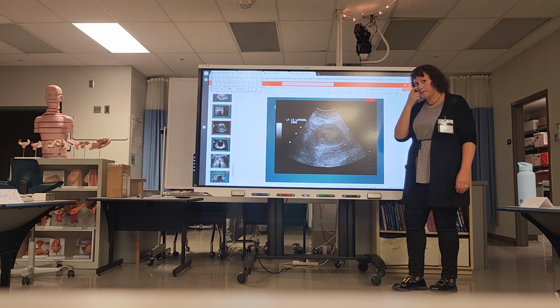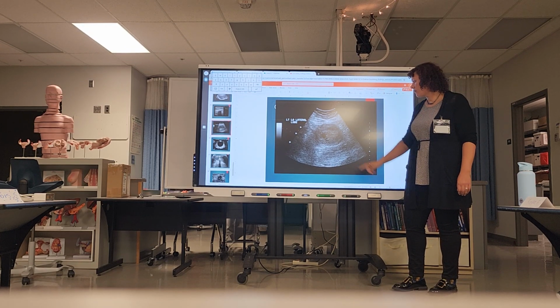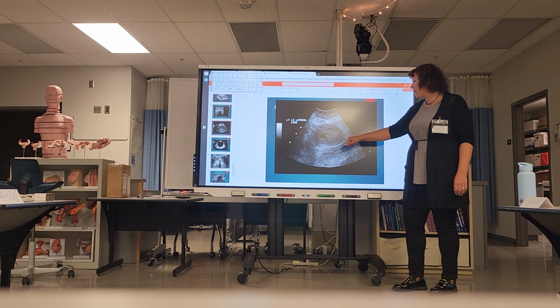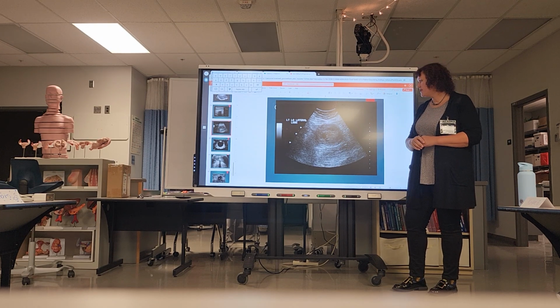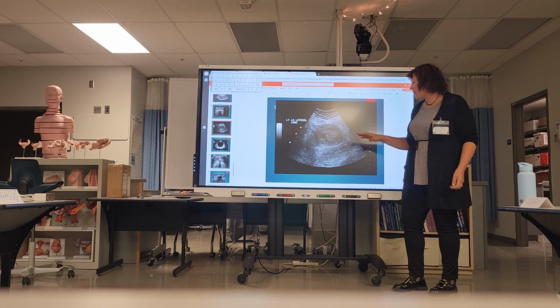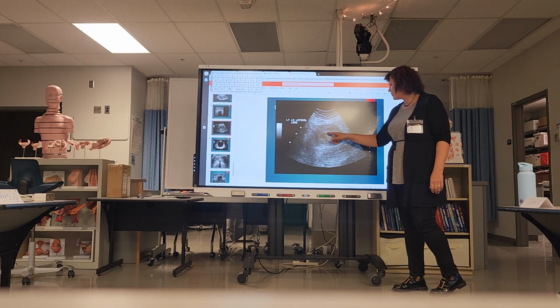So is it not complex just because such a small portion of it is cystic? Yeah. If it's half cystic, half solid, then it would be complex. If most of it is solid, then it's solid, with just little areas, probably of necrosis.